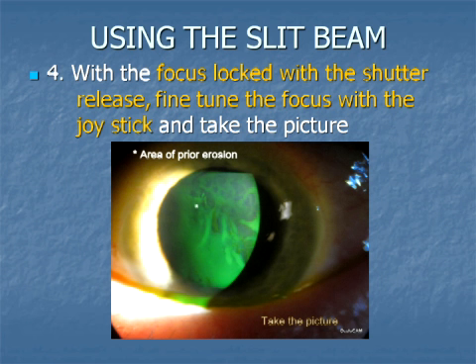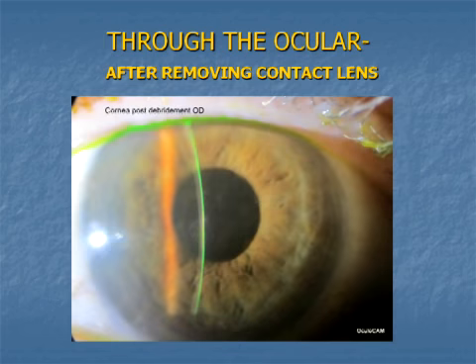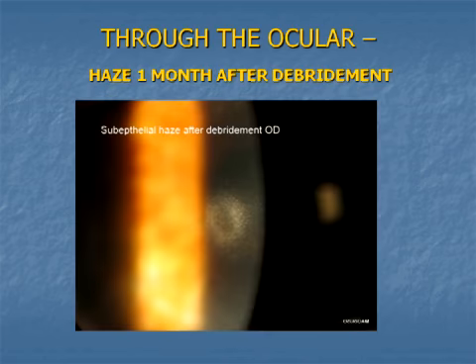Here are several examples. This is a central corneal lesion immediately after debridement with 20% alcohol placed in a 4mm well. Here is the same cornea shown three days later, just after removing the bandage lens. Finally, this carefully focused and magnified image shows the residual haze in Bowman's membrane.